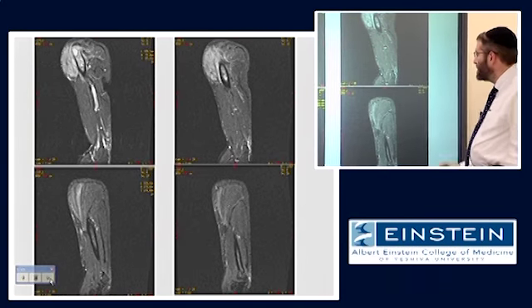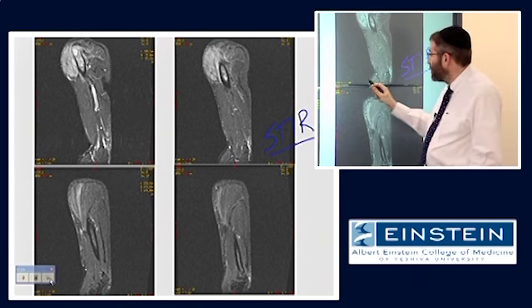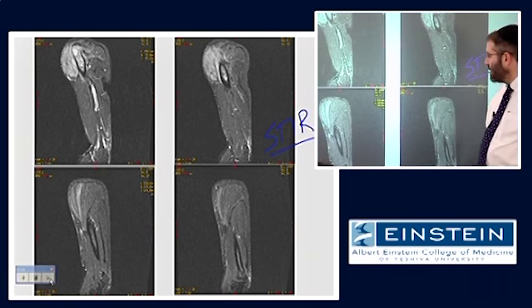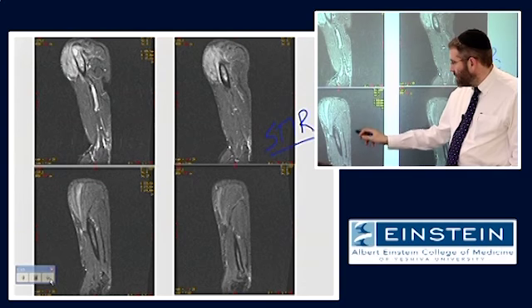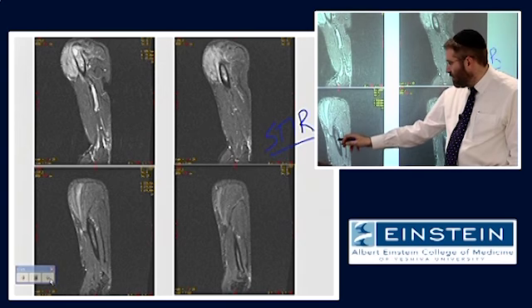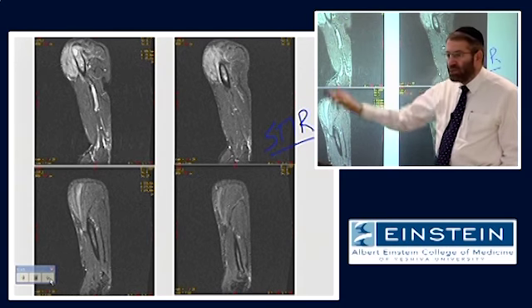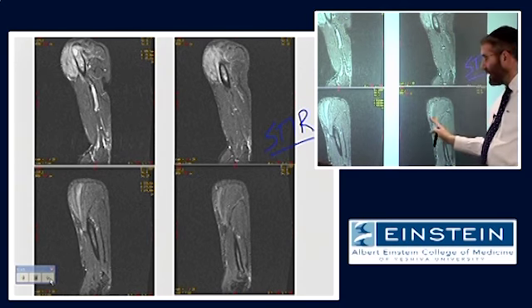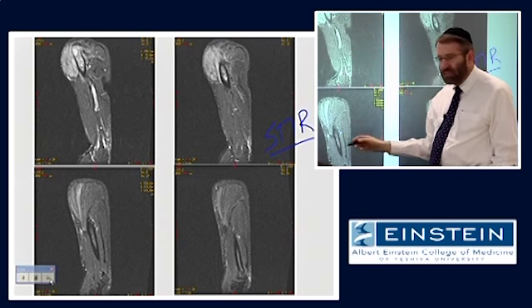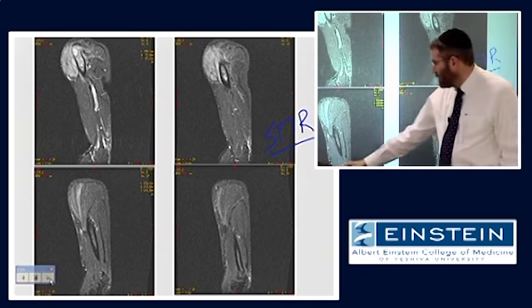Okay, this is just an example of some STIR images. Right? So this is an upper extremity with a tumor involving bone marrow and soft tissue. We can see that the fat, normal subcutaneous fat, fat between the muscles, is black, and that the fat within the bone marrow is also suppressed, which allows us to see the tumor, which is very high signal. Right? This is a non-contrast image, but certainly within the marrow, this would be very hard to detect if the fatty bone marrow was very high signal, as it would be on any other T1 weighted image.